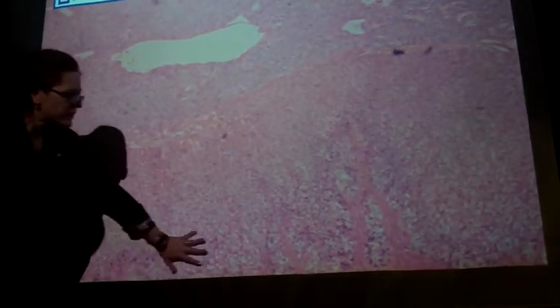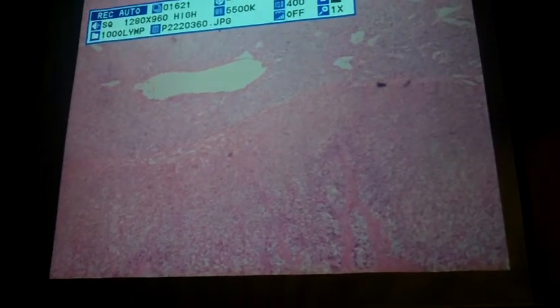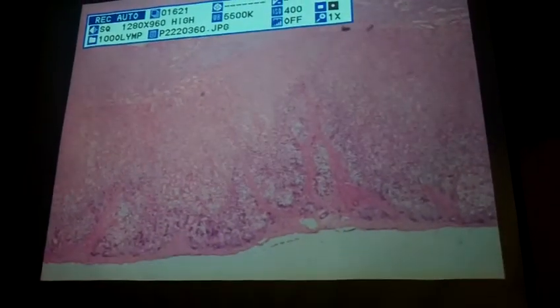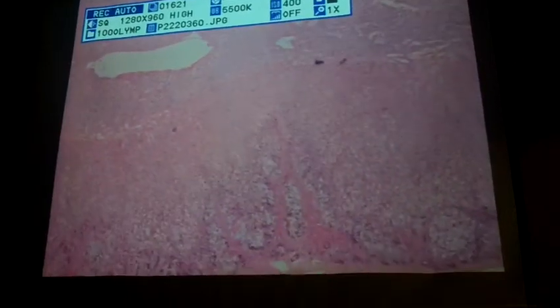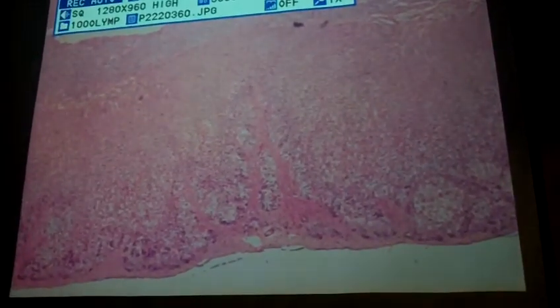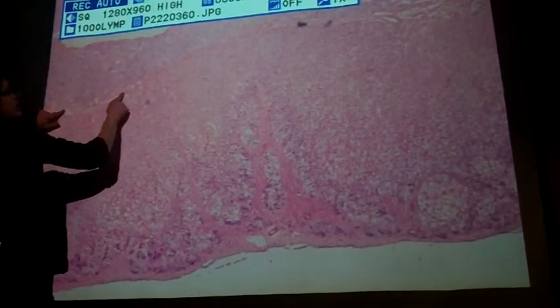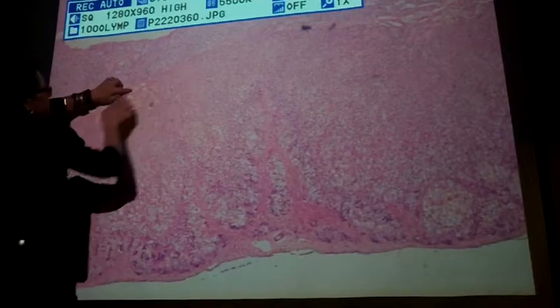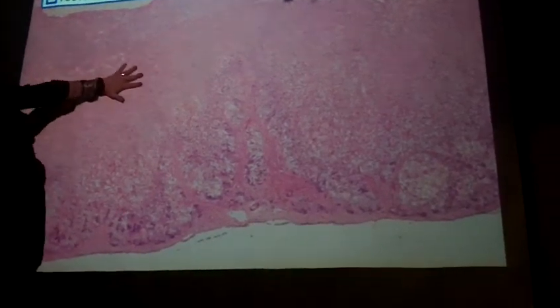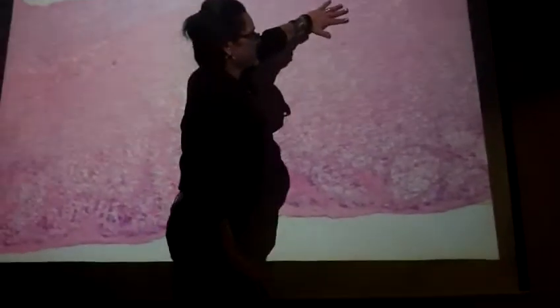Here is going to be fasciculata. And then if we keep moving down, so medulla is right here. Again, you can see the boundary. That's the edge of the medulla. Then the layer of cells right beside the medulla would be reticularis.